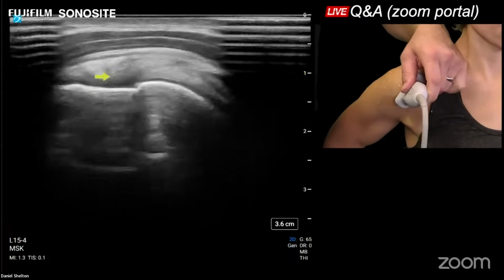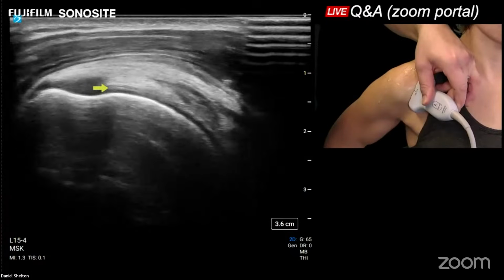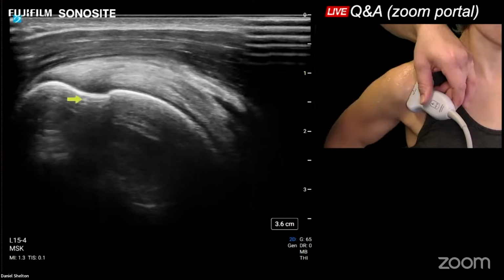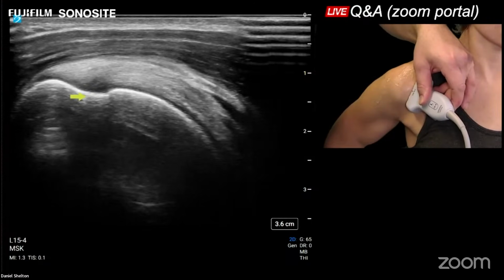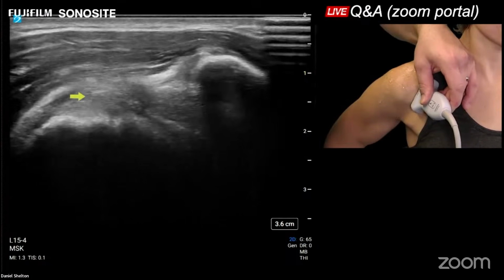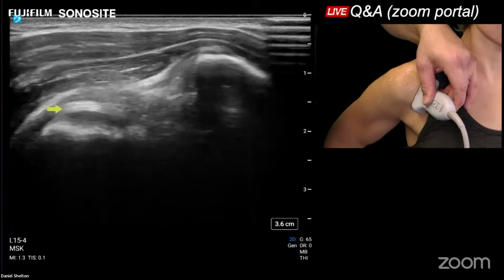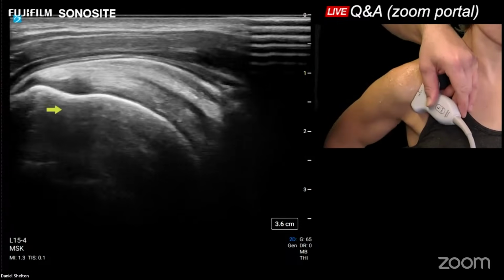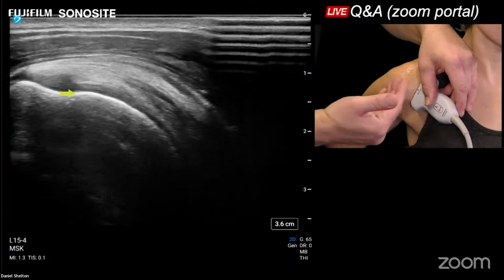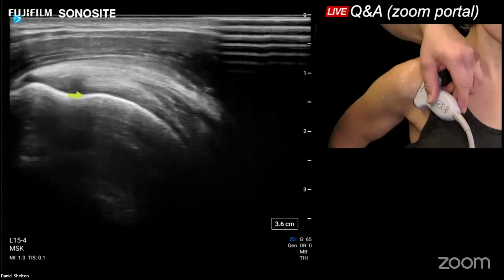Little scanning tip is the anterior part of the greater tuberosity has this inflection point that's curved. And that's just before you hit the interval. So we have a curved greater tuberosity here. And if I go any more anterior, I should hit the biceps tendon in the joint right there. And just a few millimeters laterally, I hit the anterior fibers of the supraspinatus right there. So relatively speaking, my transducers are very much laying right up against that groove where your chest meets the shoulder.